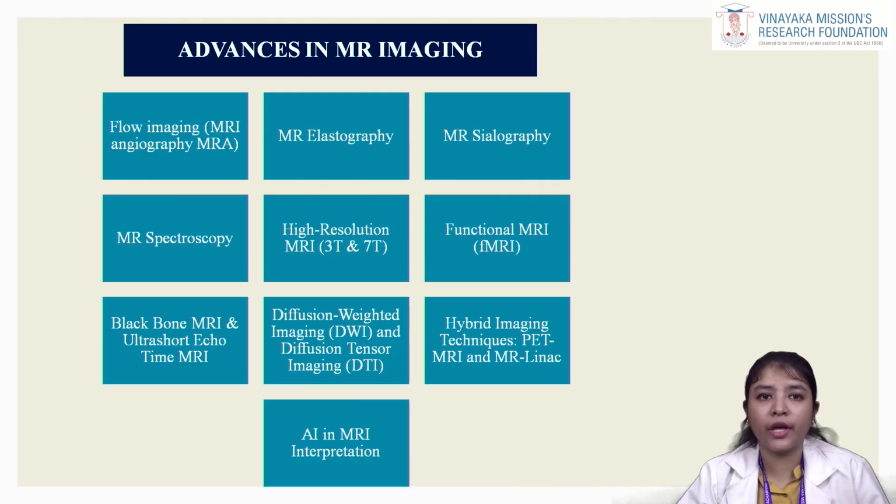MR-Linac, a fusion of MRI and radiation therapy, allows real-time tumor tracking during radiotherapy, improving treatment outcomes for head and neck cancers. And the last is AI in MRI interpretation. Here it enhances image reconstruction and helps in analysis so that it reduces human error in diagnosis, and allows automated segmentation of the dental tissues.